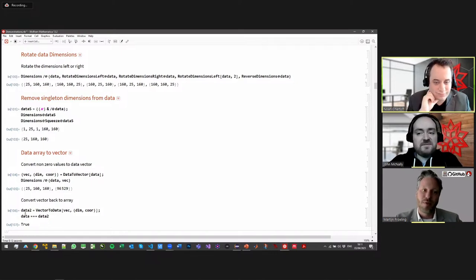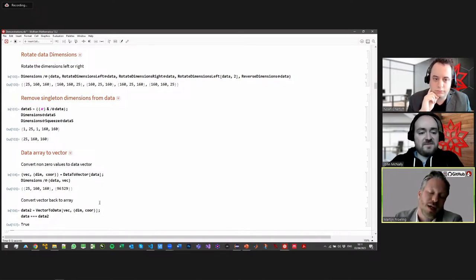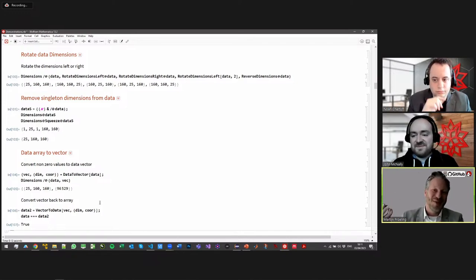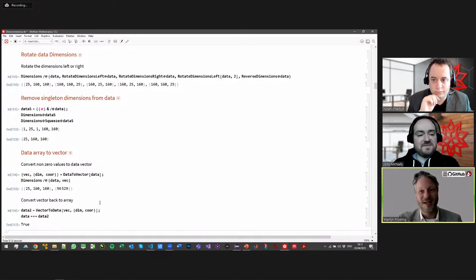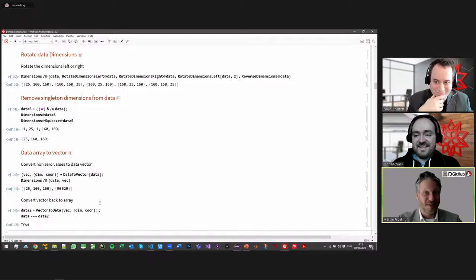So this makes it really simple, for example, to do logical operators, like if the value is 0, then delete the coordinates and only process the coordinates that are valid. These kinds of higher-level things are very specific to working with numeric arrays, which Mathematica actually is not. It can do it, but it's not designed to do it, right? There are a lot of languages designed to handle large numerical arrays, and with Mathematica you have to really force it to think numerical. By default it says, well, no, I want to do symbolic. No, you're going to do things. Everything has to run numerical now.